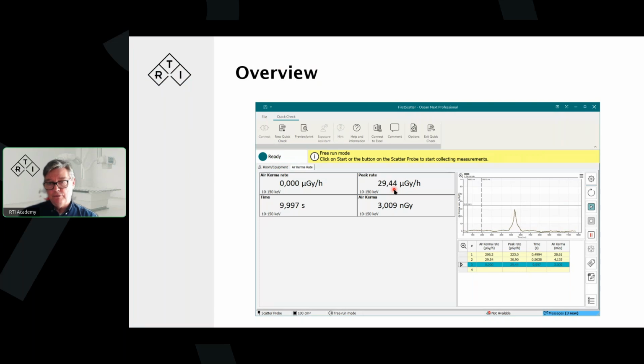The thing is that if you have a slower system, maybe an ion chamber based, it may be so slow it doesn't pick it up. So that may be the false reading, that it's not picking these quick events up. It depends on what you're used to and what you're expecting, and what you are looking for. Are you looking for the very peaks, or are you looking at the actual dose that we're capturing?